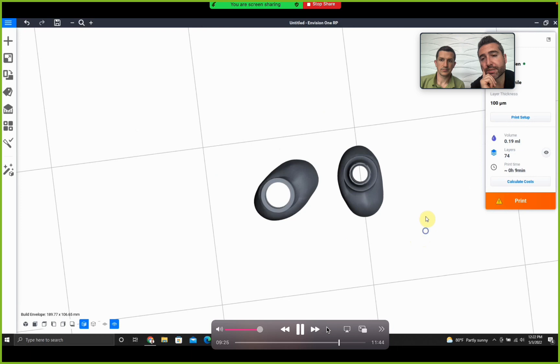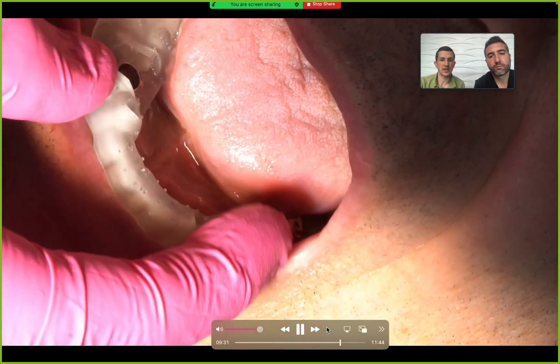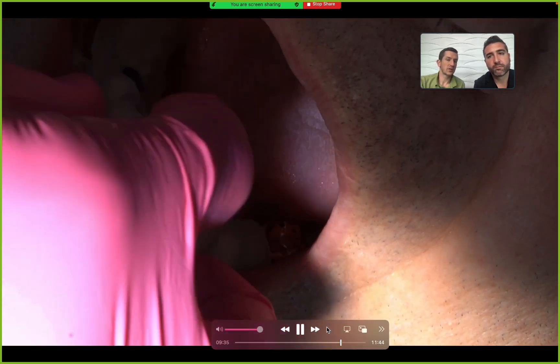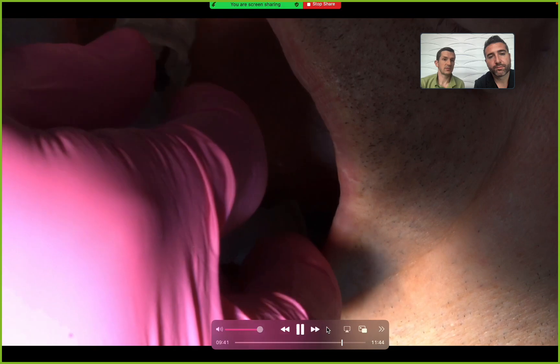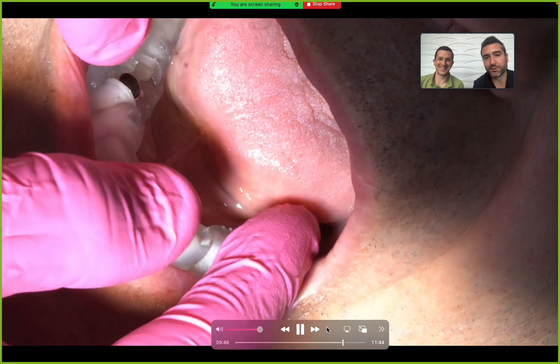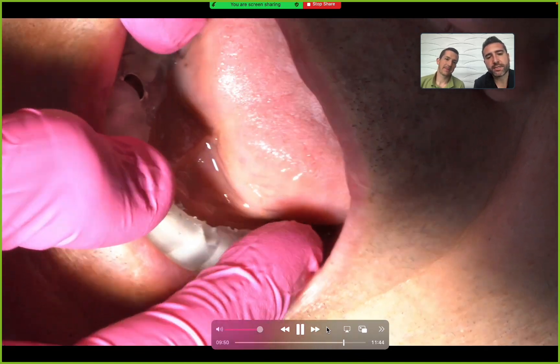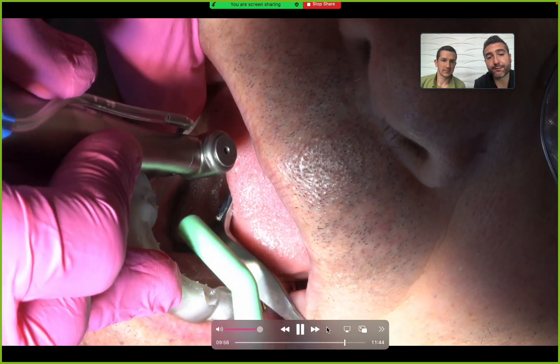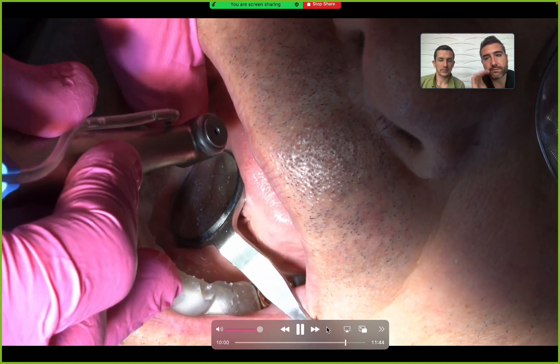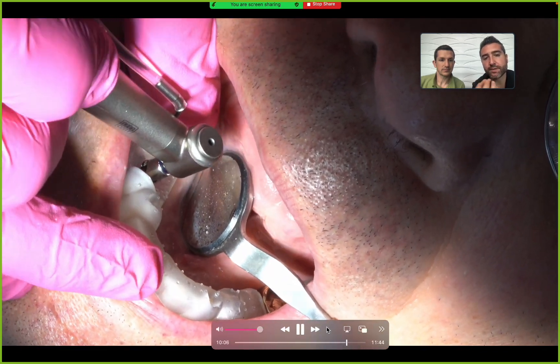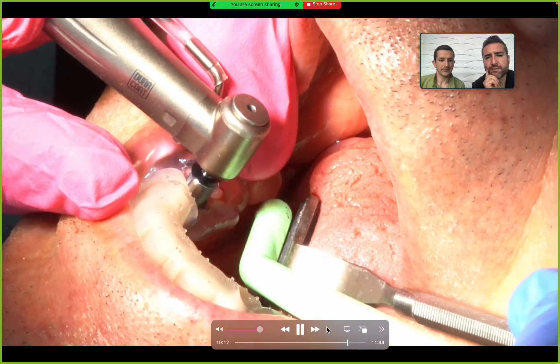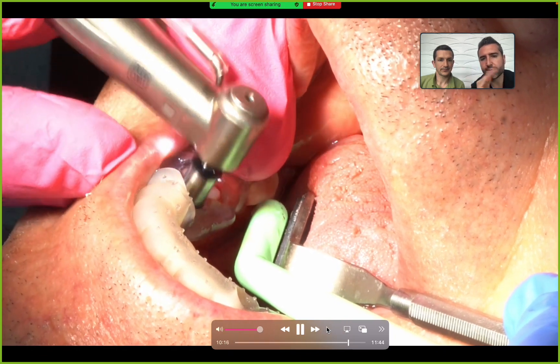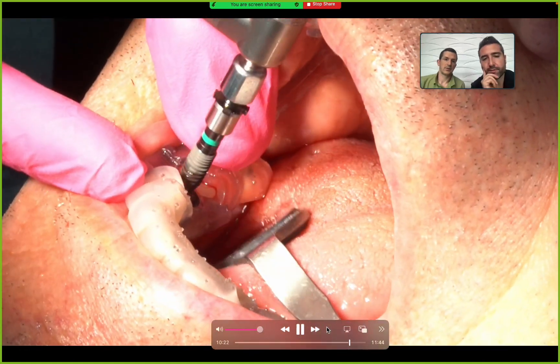This is the illustration of the case we just went through - getting the guide placed, trying everything in. The surgery was about 20 minutes tops, with me standing over your shoulder filming. The main thing is making sure your guide fits nice and everything's seated. Urus implants have a fully guided system that's timed and guided. Even the implant goes through the sleeve, so everything is depth controlled. The intimate fit of the pylon kit to the sleeves is remarkable. Everything is very precise with very little wiggle room of the long pylon into the sleeve. It's one of my favorite implant systems.